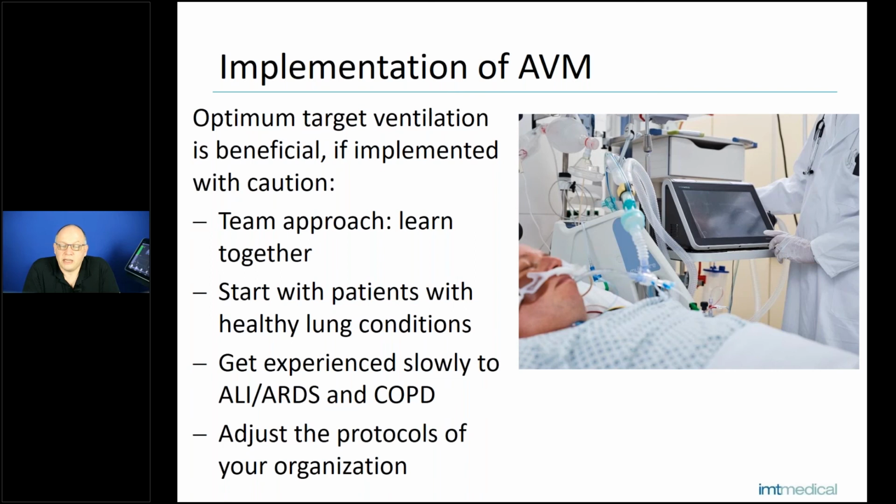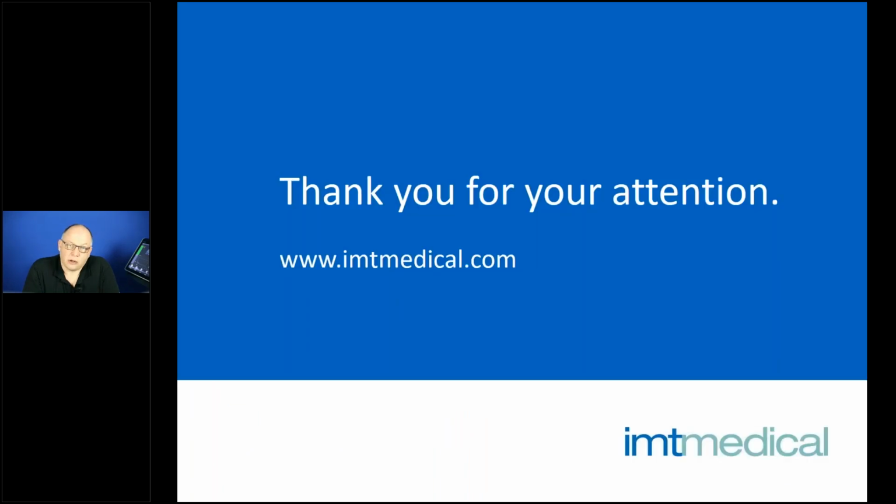And the same for ARDS or restrictive patients. They are always taken care of, because it really is looking for the least work of breathing, and that guarantees low tidal volumes and adaptive respiratory rates. Okay, so there are no more questions, but if there are some questions, you can raise your hand, you can ask. I'm still there for answering. So everything understood, fine.